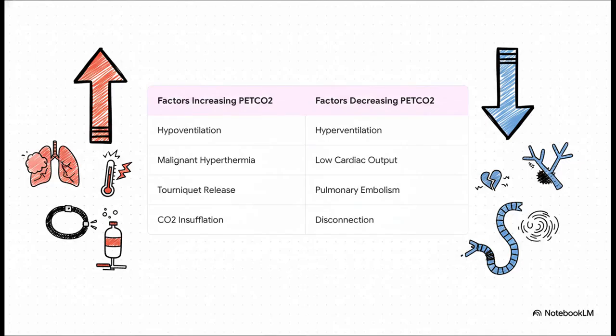This table just brilliantly illustrates how many different clinical events can cause a change in our end tidal CO2. An increase might just be simple hypoventilation, but it could also be a catastrophe like malignant hyperthermia or a CO2 embolism during laparoscopy.